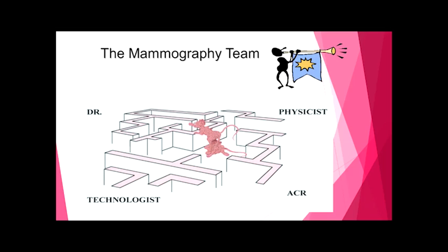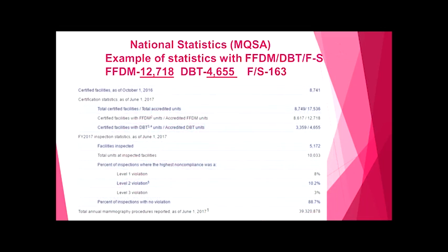When I first started and did my first ACR application, and they asked me about my partnership with my medical physicist, I had to laugh because I just knew his name because it was on a piece of paper on a report that I kept in a binder in my office. So as we got started on our accreditation package, the physicist and I did become well known to each other, because there were a lot of questions that he had to help us ask. And it was true of the physician that participated also, and the technologist, and of course, whatever accrediting body you were approved through.